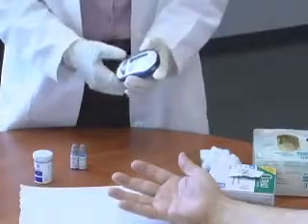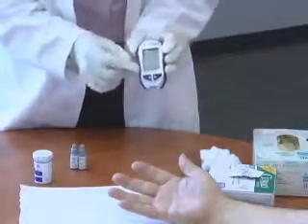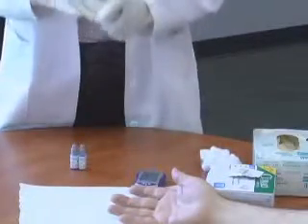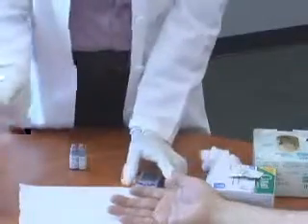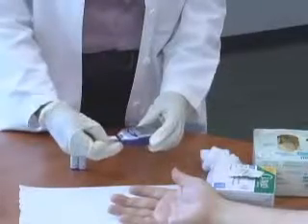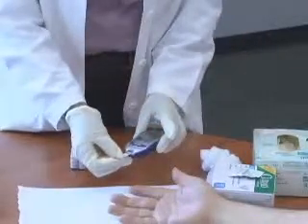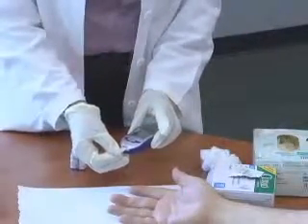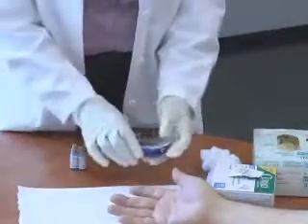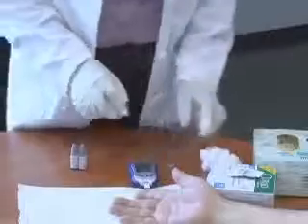Now the meter is blinking and showing a test strip icon. You take the test strip out and close the cap — you always want to keep the cap closed because there's a desiccant on the top of that cap that keeps the strips from being exposed to moisture. Place the strip so that the metal side goes in first with the name side up. Press it in and push it in. The meter is now showing you a blood drop, indicating it's ready.